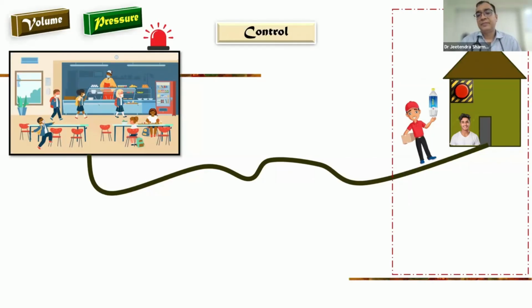Now the second agreement. What was your previous agreement? At every fixed time interval, you will get a bottle, like 6 a.m., 2 p.m., 10 p.m. Now with this arrangement, you said, I make a little change: let 3 bottles come at the fixed time interval, but in between, whenever I want, I press this button and an additional bottle will come.